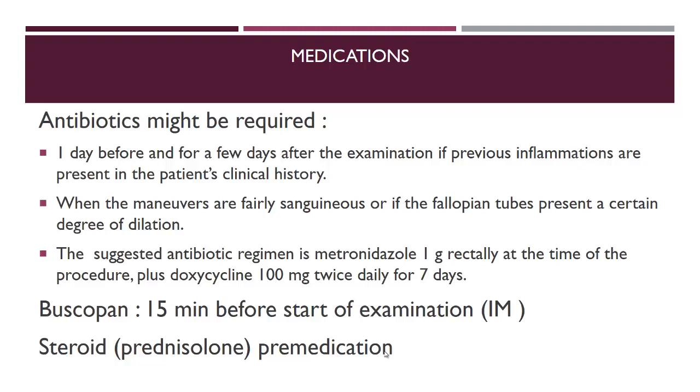Antibiotics might be required 1 day before and a few days after the examination if there is a history of previous infection, or if the patient has hydrosalpinx, since hydrosalpinx may cause stagnation and added infection.